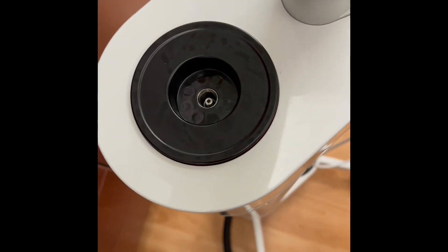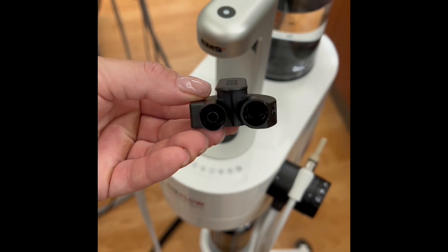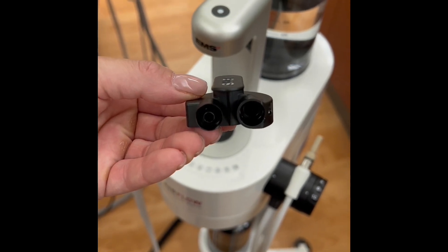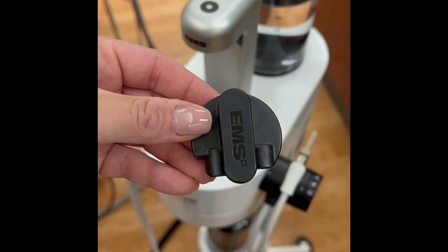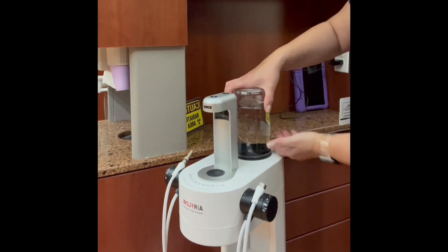Remove the cap from the water reservoir. These caps are not only used to protect the water reservoir from dust and debris when not in use, but are also used when purging the hoses. Insert the water bottle straight down, avoiding any twisting.